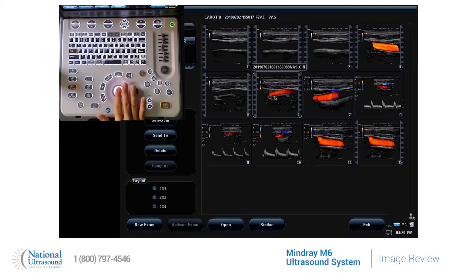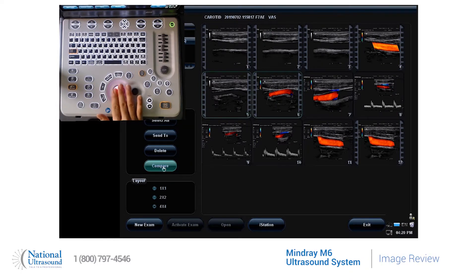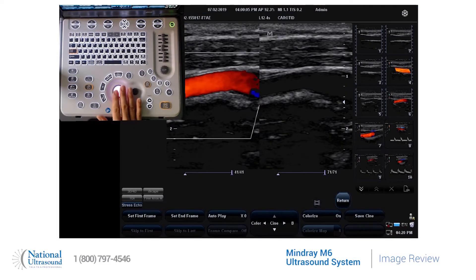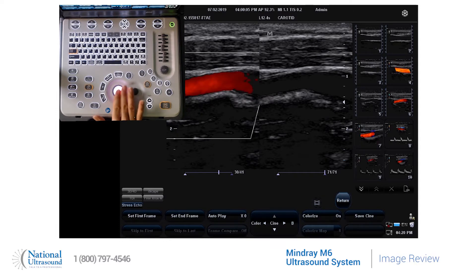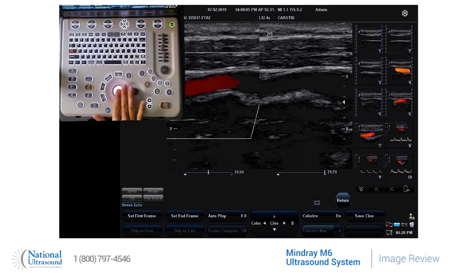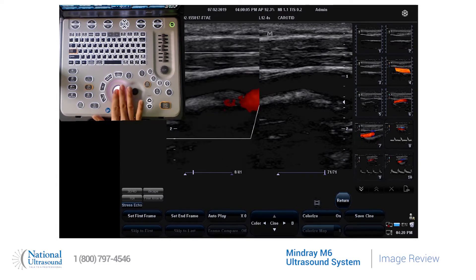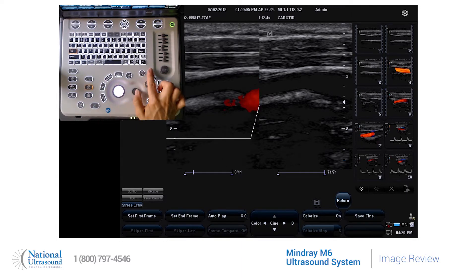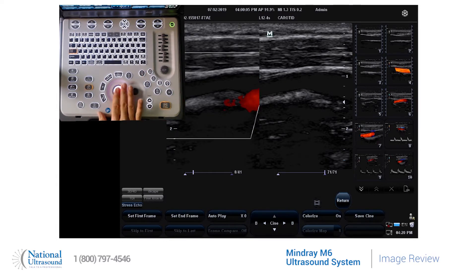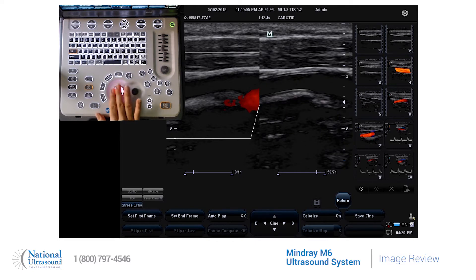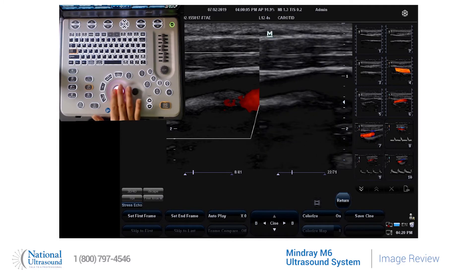There's even a Compare button, which will take you to your screen. You can then use your trackball and scroll through the cine loop on this side. Press the Dual and scroll through the cine loop on the other side.